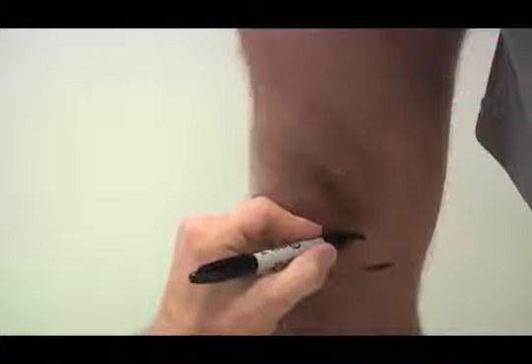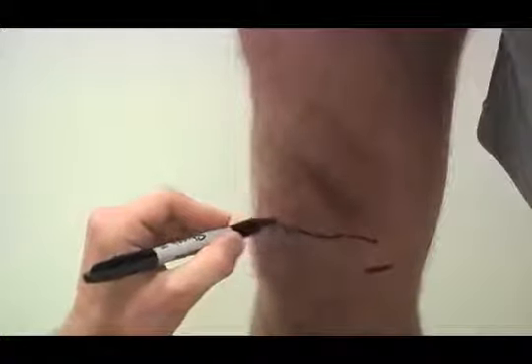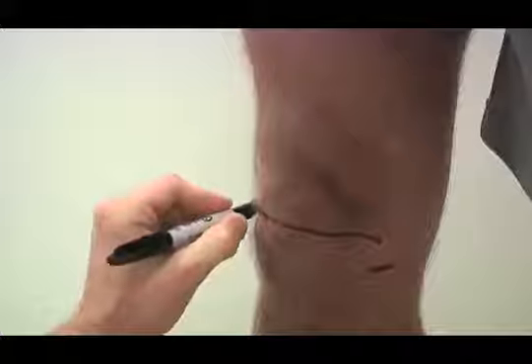Step two is finding the anatomical landmarks on your patient's knee. Start by finding and marking the medial joint space. Next, measure 3/4 of an inch above your medial joint space to find your knee axis line. Draw a line across the knee axis line. Find your lateral joint space.